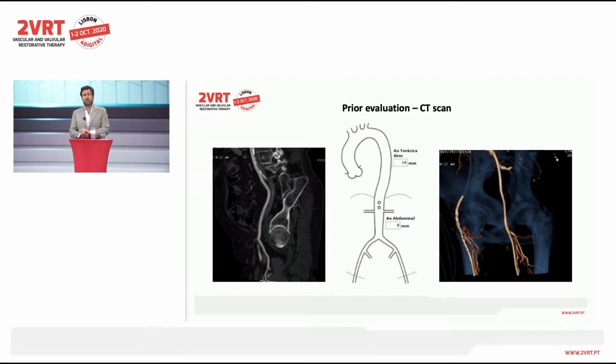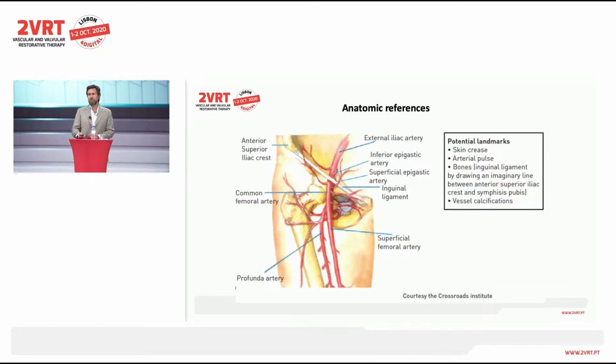And for us, at least in my expertise, I found that the prior CT scan is essential for me to know what I am going to be presented with. If you can do a good study, in this case with the software we use, we can easily check every centimeter of the femoral and iliac arteries and foretell if we're going to have sites of complications: where's the calcium, where are the strictures, how is the angulation. All of this is something we have to bear in mind so that you can choose what you're going to do.